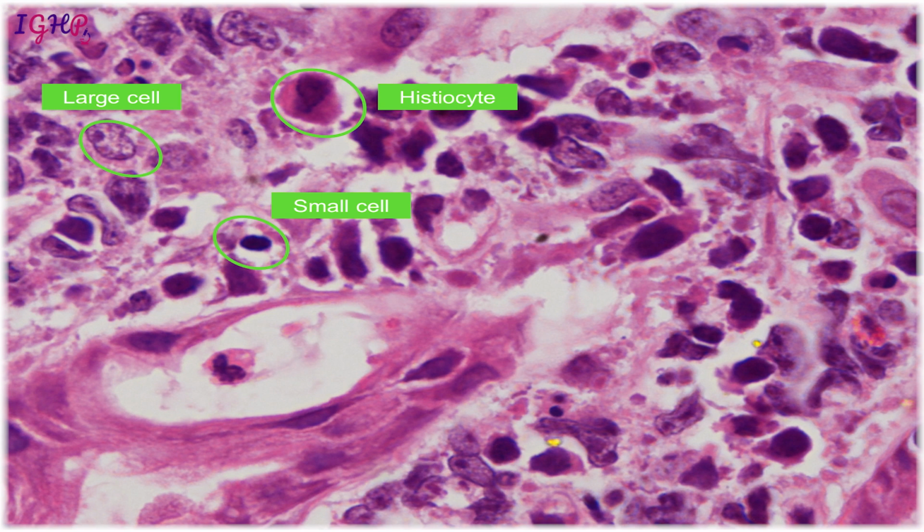The second thing that you can always compare your large cells with is the histiocyte. So one is your lymphocyte and the second is your histiocyte, if you are looking at a lymph node. If you have a histiocyte in hand, you can compare the size of the nuclei with the histiocyte, and if they are equivalent, then also you can say whether the size of the cell is larger or smaller.